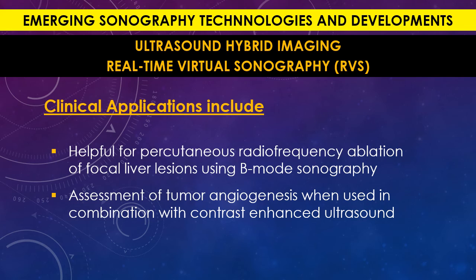It helps in guiding the needle precisely to the tumor area and getting into the center, and at the tip of the needle there are umbrella-like wires that open, and with the electric current, they will char or burn the tumor inside. This technique is called RFA, radiofrequency ablation.